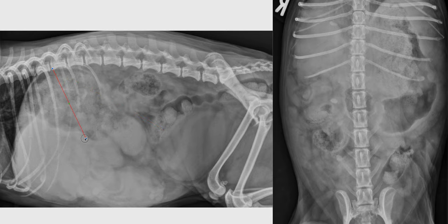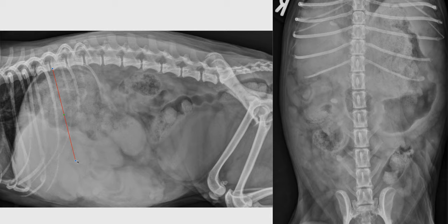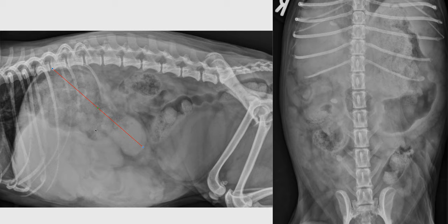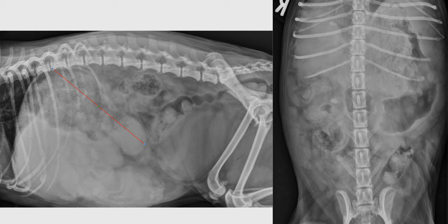So in a normal dog of that conformation, we would expect the gastric axis to be something like this. You can see that in this dog, when we trace the gastric axis between the fundus area and the pyloric antrum — which is this fluid-filled part on the right lateral projection — we see that this is quite far displaced caudally and dorsally from what we would expect normally. So a displacement of this gastric axis caudodorsally.